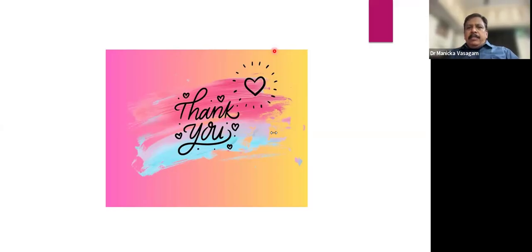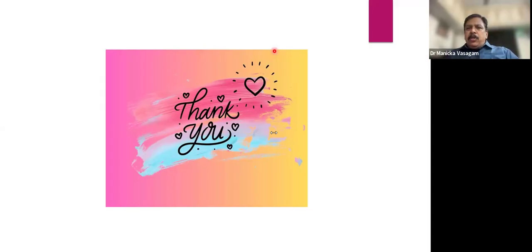Shall we do double cone technique for blunderbuss canal after placing 4 mm MTA in the apical region? That's the question. There is no double canal. It is called the roll cone technique. No, double cone technique, I think I misread. It can be combined and it can be rolled as a single cone. It is called custom cone or tailor-made cone, customized cone we say. So for blunderbuss canal you can use that type of technique. Definitely you can use it freely.